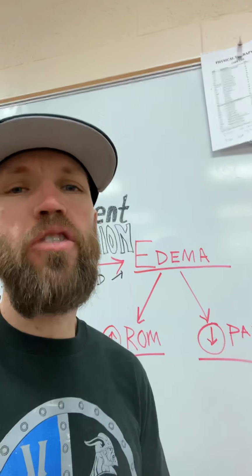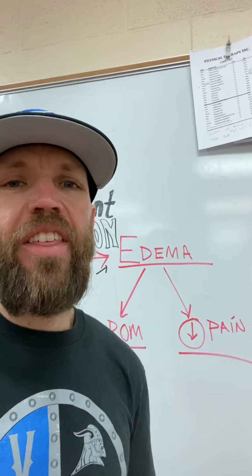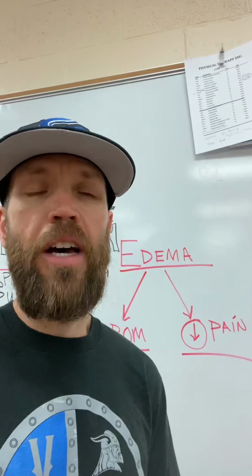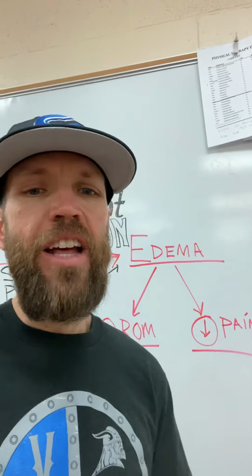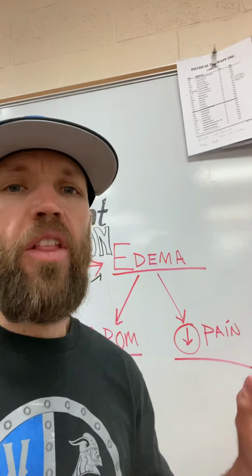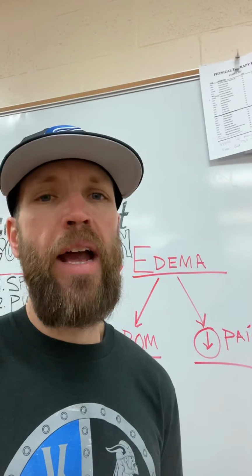In fact, your textbook that you would have used in our program would say that there are three primary goals of using intermittent pneumatic compression. Number one is edema, but there's a downstream effect to that. If you take out the edema, then immediately you're going to up range of motion and you're going to decrease pain. And all of us know that those two things are the primary factors in getting our patients back better.